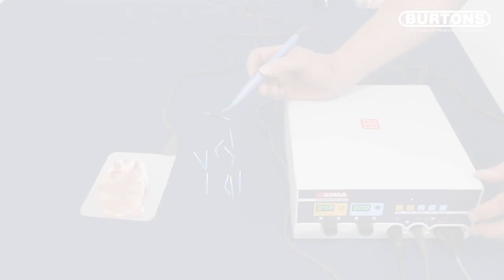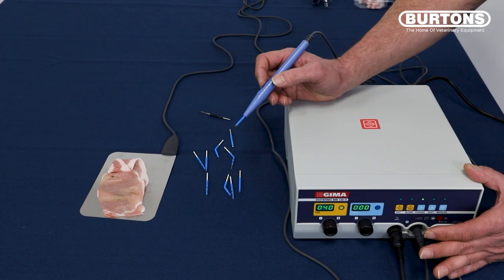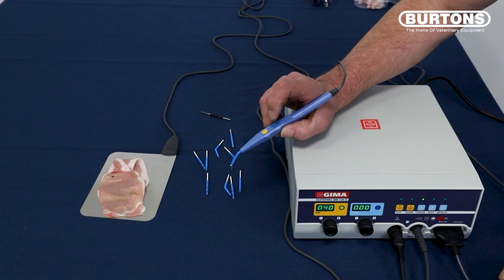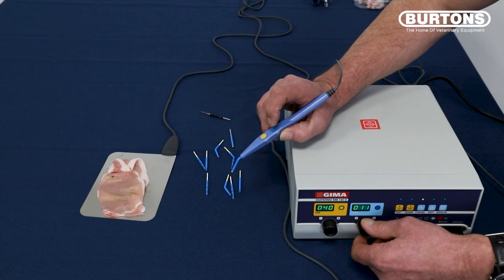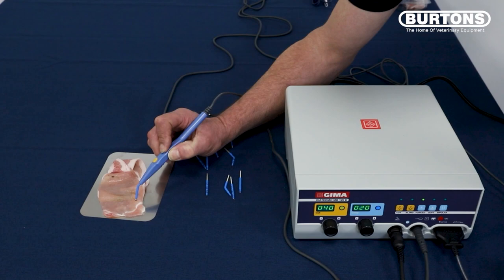This time we're going to go to the next button, which is forced. Forced just allows you to push the cauterizing energy a bit deeper. And because we've got a blue switch, we need to use the blue button. We need to put the power on here, so we're going to turn the power up to start off at 20. Foot on the foot pedal, blue button — and you can possibly hear the difference in tone. It's now forcing the current a little bit deeper.